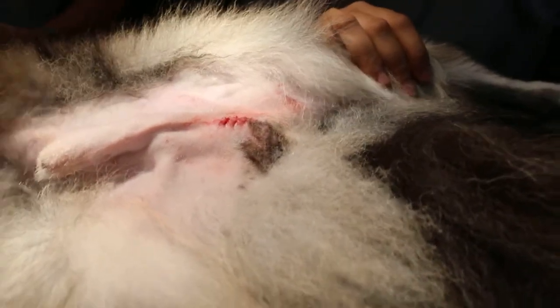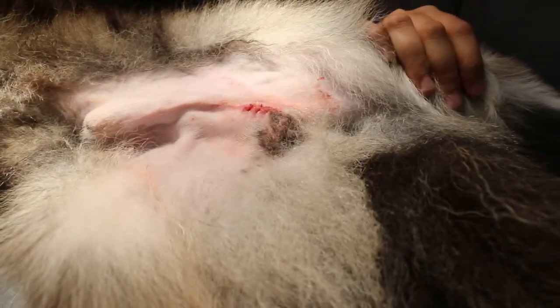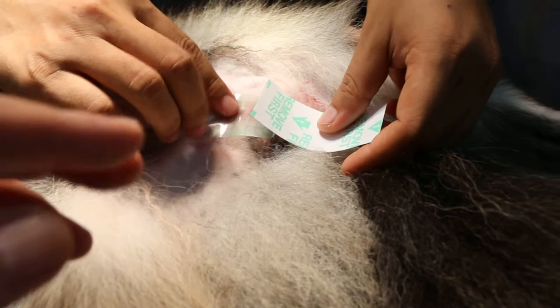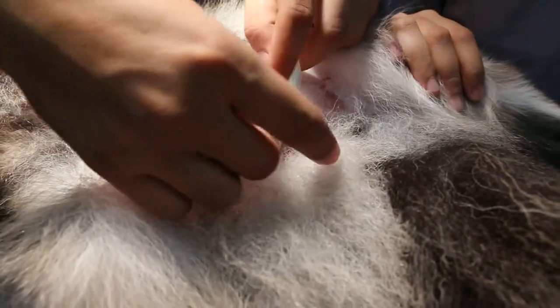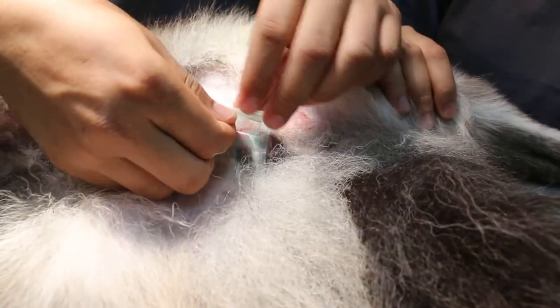As you can see, we have finished the castration. We put the bandage up so that it won't leak. Normally it should be the other way — this way is the wrong way. Normally it should be vertical because of the scrotum. So we put it just to protect, and then we have the e-collar.